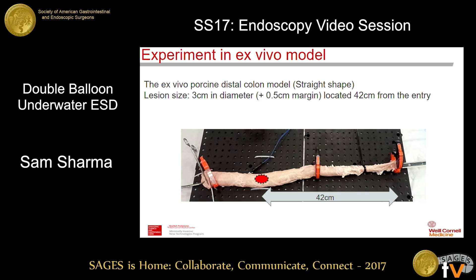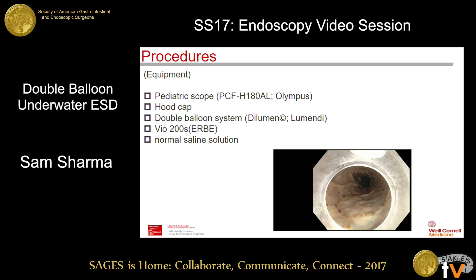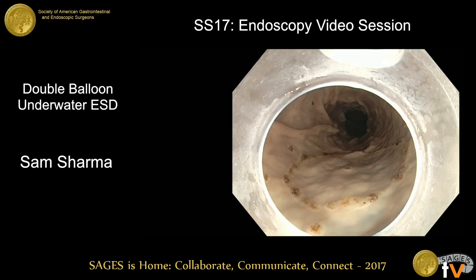To show you our experiment of ESD with the double balloon system, we created an ex vivo porcine model. We created the region which is 3 cm in diameter plus a 5 mm margin all around it in advance of the procedure. This is our setting of the experiment.